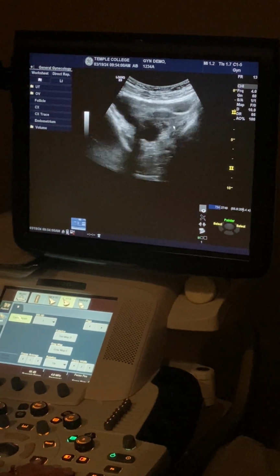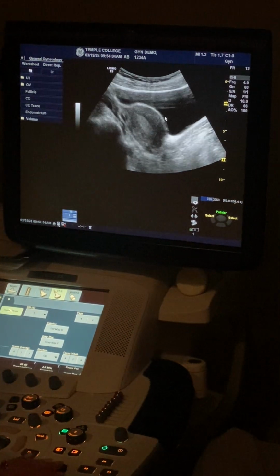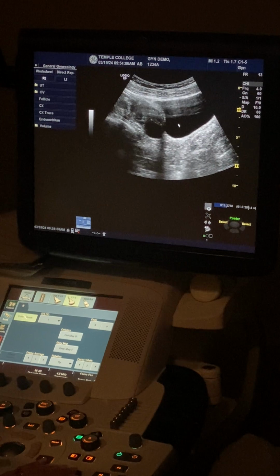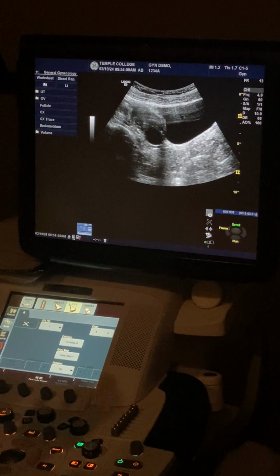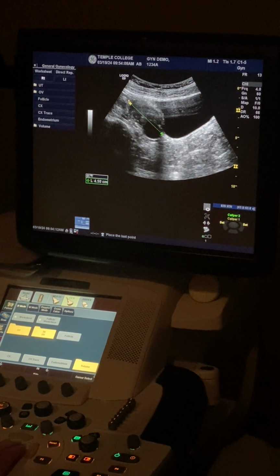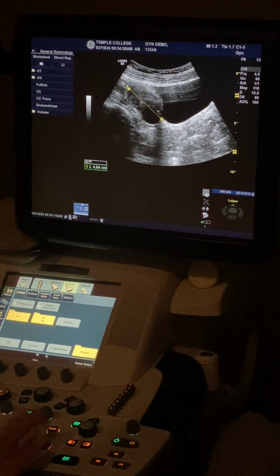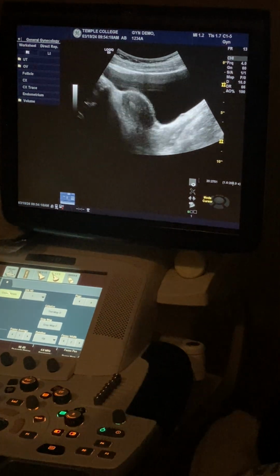And now you can see all of that ovary, and you can figure out what's long and what's trans. That looks like long to me. Everybody agree? Just from one end to the other. That's your length measurement. Do the same thing for the other ovary.